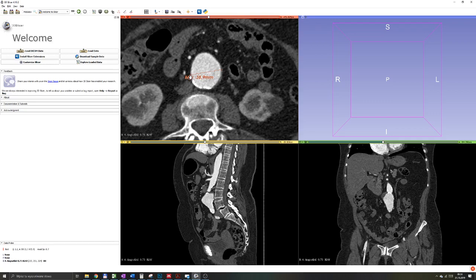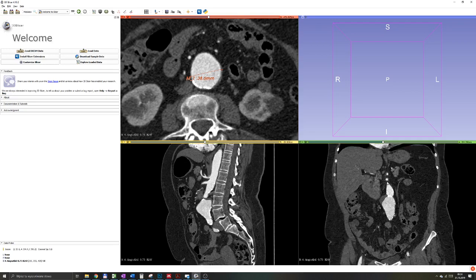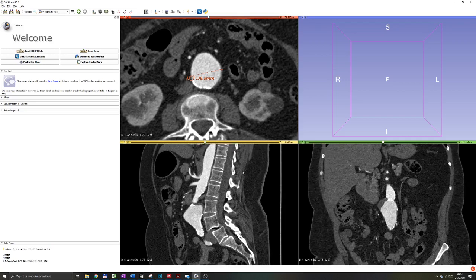You can click on crosshairs at the end of the line and drag them if you want to modify the measurement. You can also do the same thing on other planes.